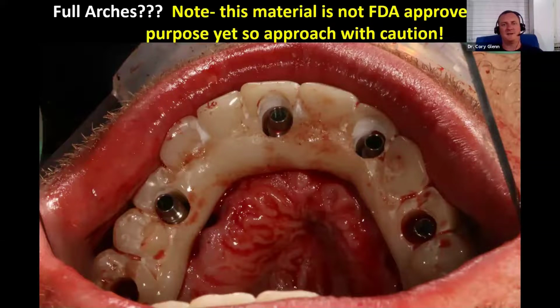Full arches, again, I started out saying with this new resin, I've done this on probably 15 to 20 full arches at this point. So the workflow we usually do is a bone reduction guide, a drill guide, and then we have the prosthesis where it indexes off the bone and it puts it at the right vertical and occlusal position. And we just pre-make the holes so that our cylinders are emerging through that because we're guiding it. We know where they're going to end up. And so this is right after placing the implants and putting temp cylinders on. And again, everything lined up perfectly.